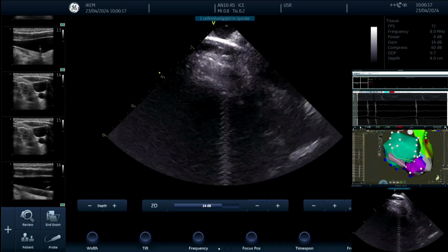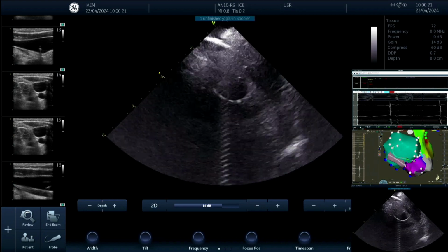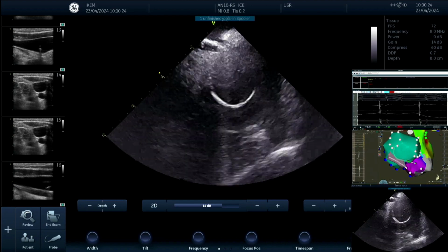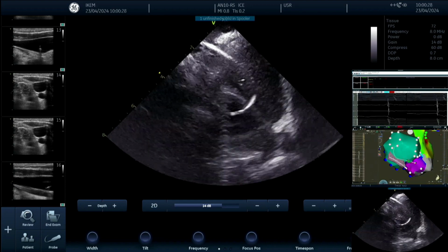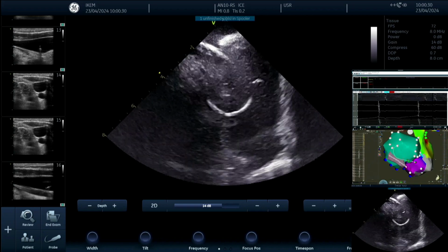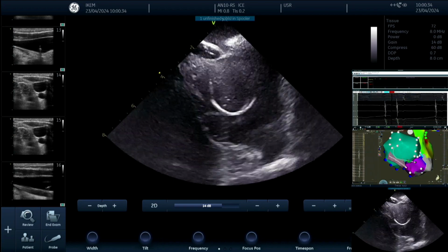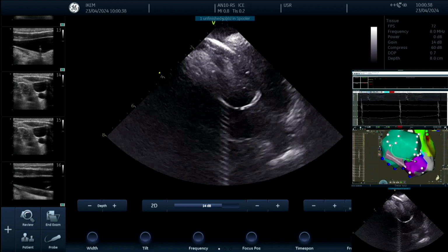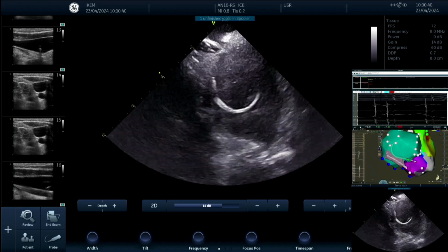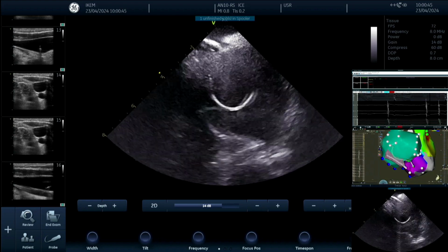We have so many catheters in the right atrium, so sometimes it's shadowing from all sides. Yeah, this is the catheter. Can you see? This is the left side of the pyramid space, then from the right side, and then from the floor of the coronary sinus ostium. Yes, exactly. This is exactly this triangle, or pyramid, which was described by Dan.